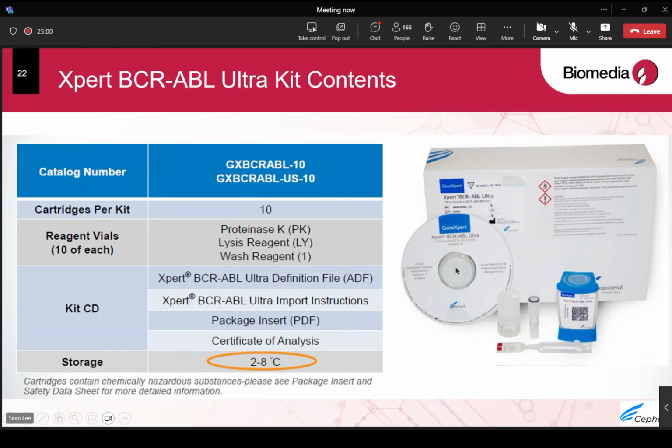And the storage of this kit is quite important. You have to keep it at 2 to 8 degrees Celsius. Remember, you cannot keep this at room temp, because proteinase K is an enzyme, and if you keep it at room temp, it will degrade.